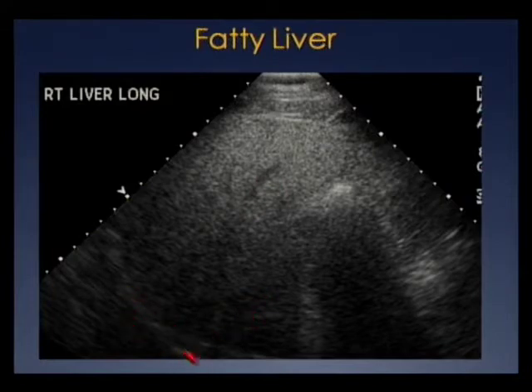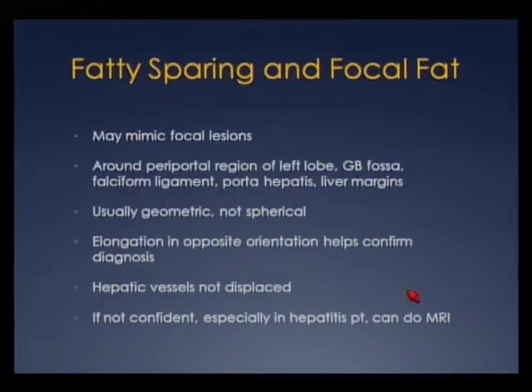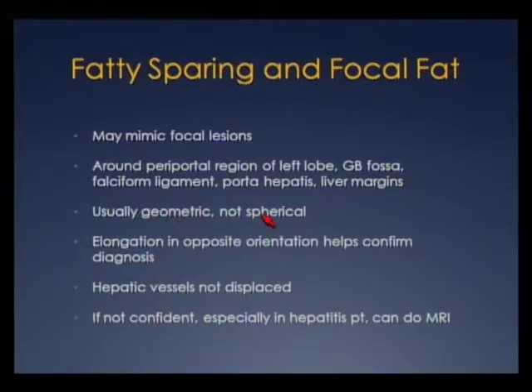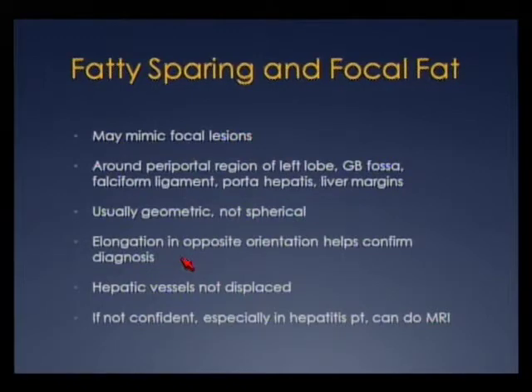We lose any vascular definition and we don't see the diaphragm well. Fatty sparing and focal fat may mimic liver lesions, and we typically see these around the periportal regions of the left lobe, gallbladder fossa, falciform ligament, porta hepatis, and liver margins. Fatty sparing and focal fat are usually geometric, not spherical, and if you scan from the opposite plane it should elongate — this helps differentiate these entities from a liver mass.